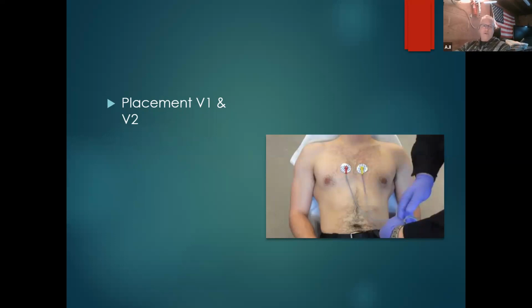But if you remember, if somebody has a hairy chest and you go to take these off, it could be painful and sound like Velcro. That's bad. All right. Unless their wife's there, you let them do that. The wives will be all over doing that.